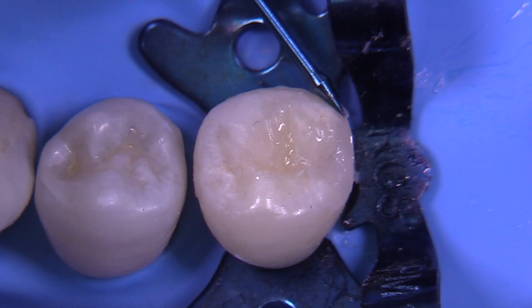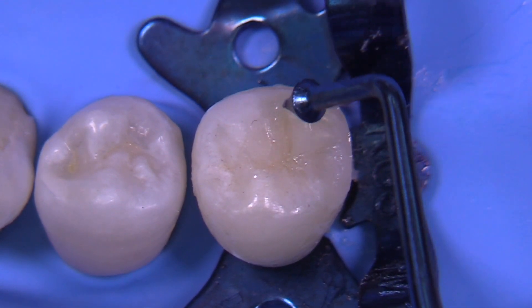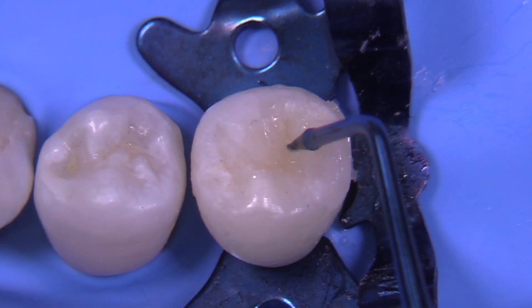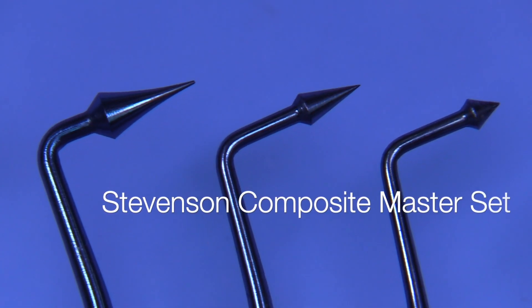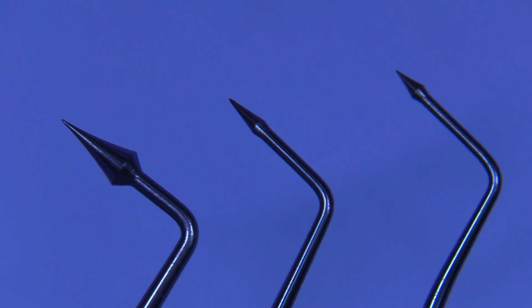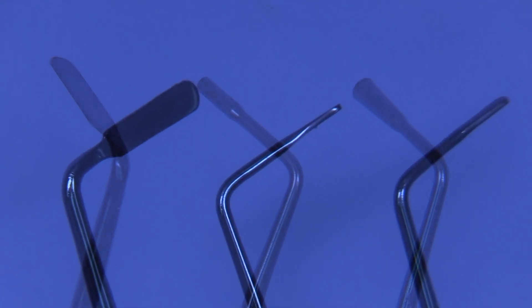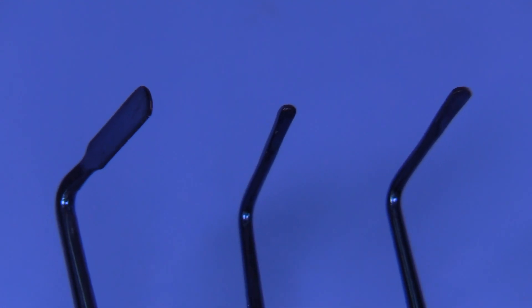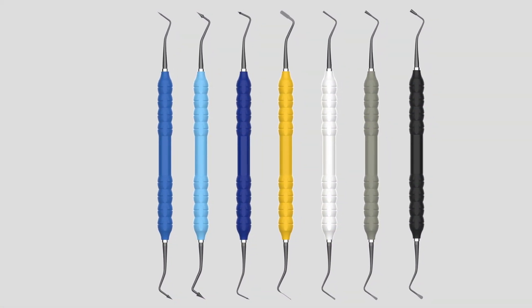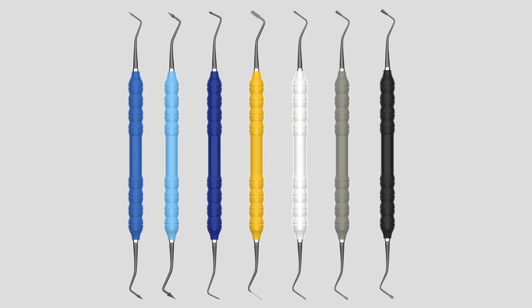We make the anatomy flow by looking at the adjacent tooth and thinking about what clues you have on the tooth structure that was not part of the preparation that you can follow. We're using some of the other composite instruments — this is the Stevenson Composite Master Set. There are seven instruments; I'm showing six here today. There are going to be 14 different ends, color-coded so you know which to use first, second, third — going from light to dark.